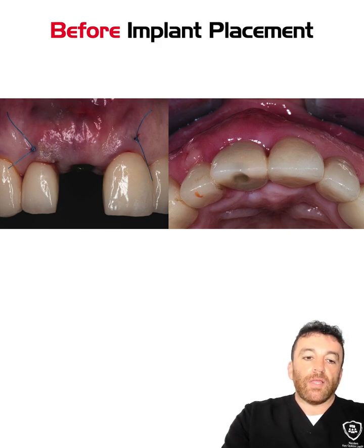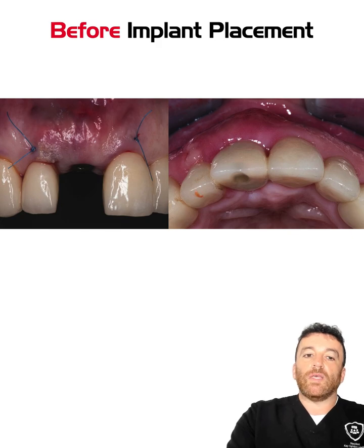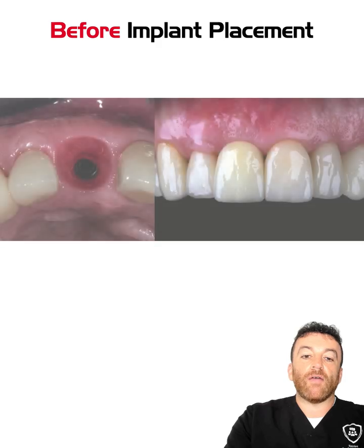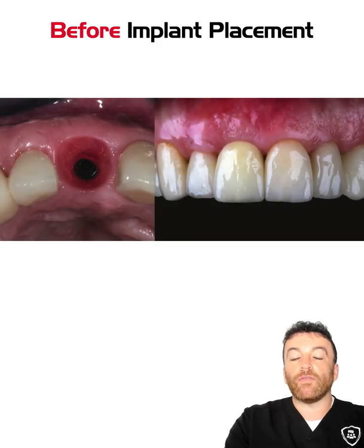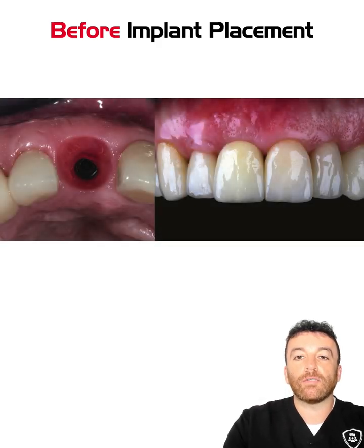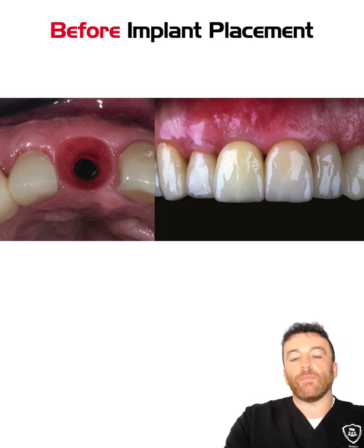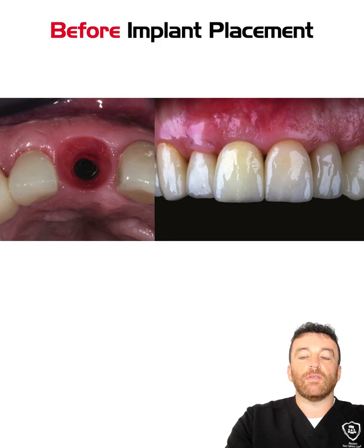Simply leaving that in place for a number of weeks, 4 to 6 weeks, and then going and exposing your implant or placing a new implant allows for a much longer lasting implant procedure in place, ensuring that if you have that shine or gray through color of that implant, that despite bone loss, we don't end up with potentially an ugly aesthetic complication on our case in the future. So this is a great solution.